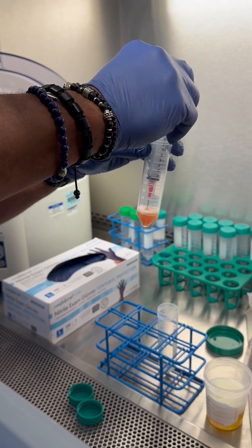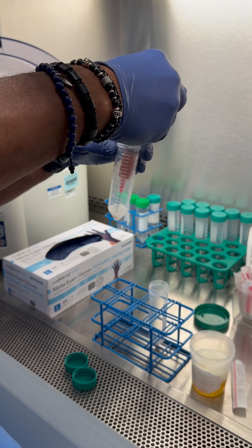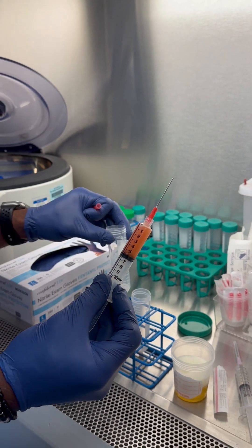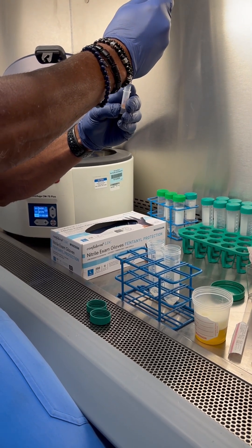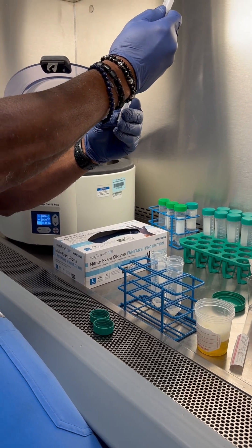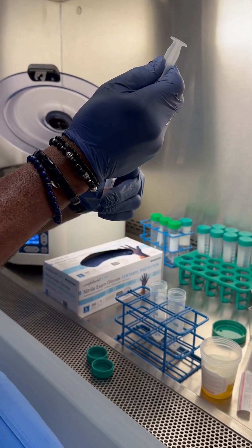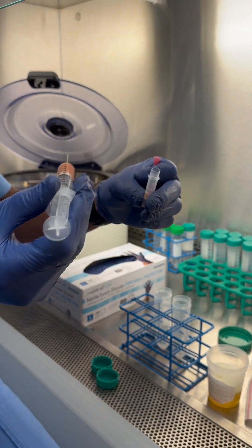That should be pretty good — let's see how much we have. We got right to six cc's, so we have six cc's total — that's perfect. We'll divide it up three cc's times two. This is a microtainer for our Hariba; we just put in about five drops and that gets us just a little more than 250. Going a little bit less — we're right at 250 now. That still leaves about five and a half cc's.